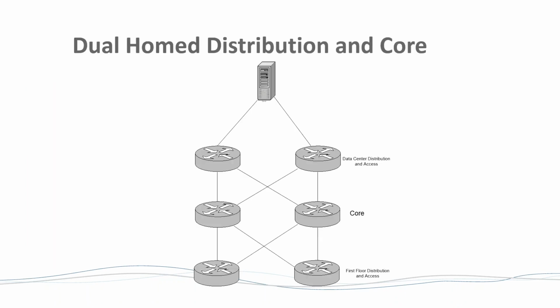Just real quick, this is a common architecture. There's kind of some core routing, and then there's all this redundancy to other routes in the organization. And we've learned today how, particularly in switching, when we have that redundancy, spanning tree is our friend. It can help us. Sometimes it makes mistakes, and sometimes you need a network person to go on there, like, for some reason, spanning tree had that shut down, and kind of reset spanning tree, and everything came up right. But it is our friend.